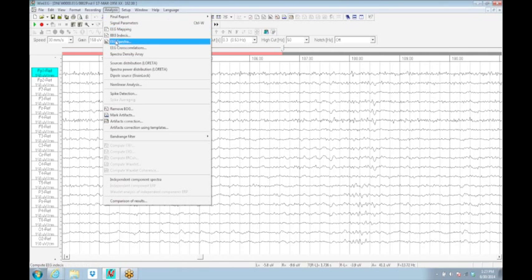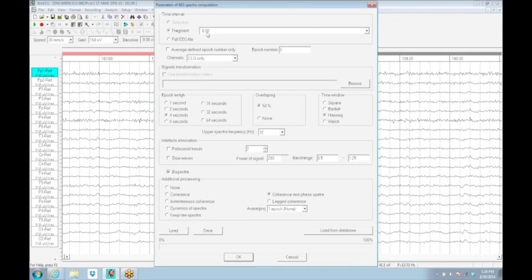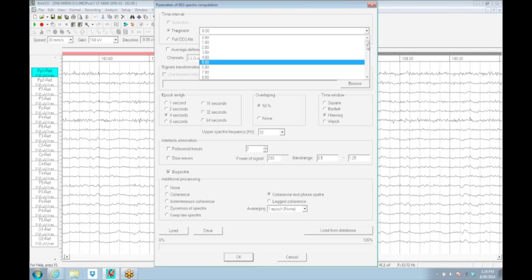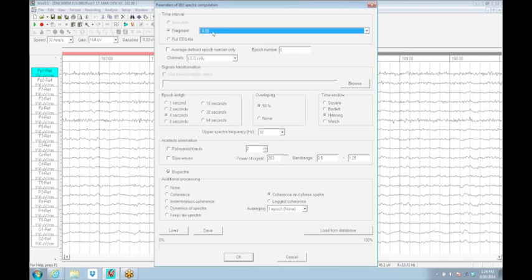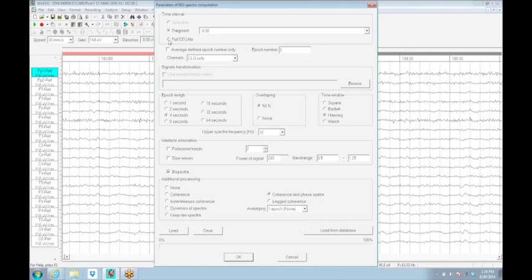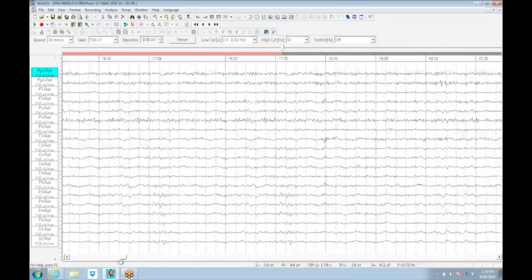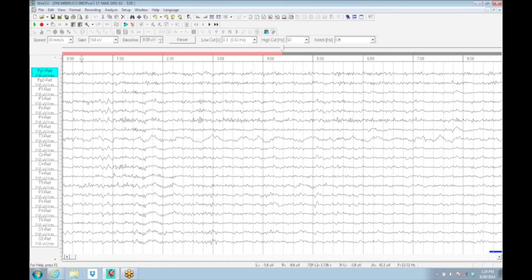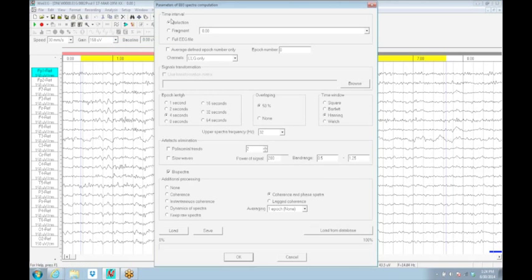The analysis we can do here will allow us to do the EEG spectrum on either fragments that have previously been defined when the EEG was recorded. This one, each second is defined, so fragments don't make sense here. But sometimes people will record and there'll be an eyes open or eyes closed or a task. You can select those predetermined fragments. In this circumstance, we can analyze the full EEG or we can find a segment. Let's say I was interested in this T3 slow wave and I wanted to analyze this separately from everything else. I can catch a selection and then analyze that selection. Under the analysis here, I can analyze the selection.